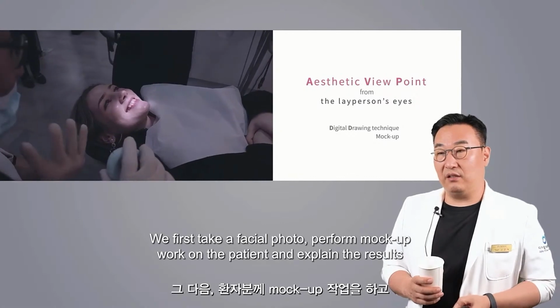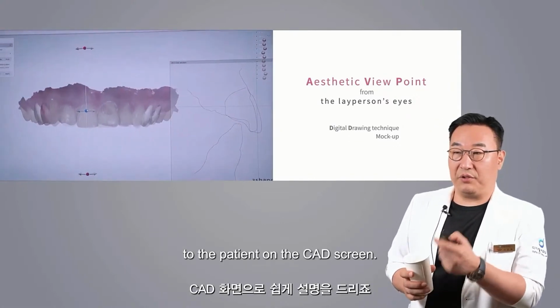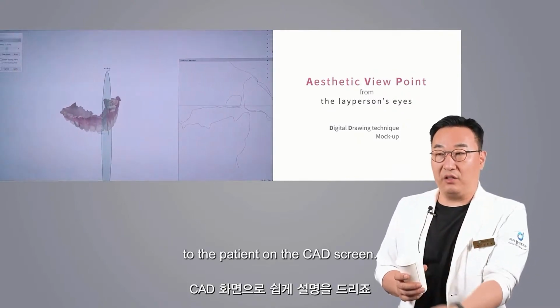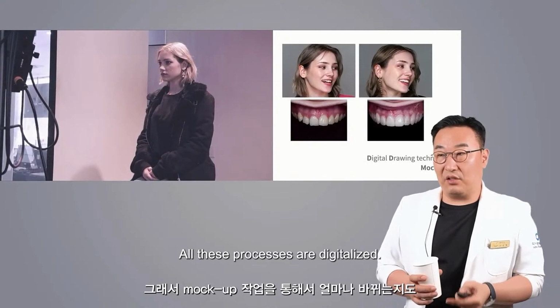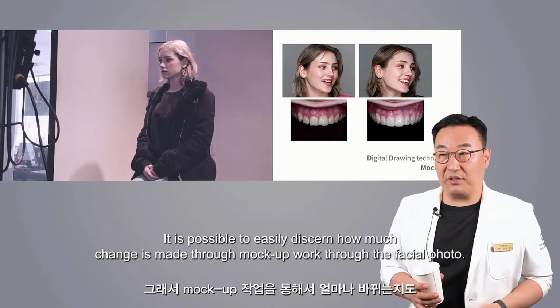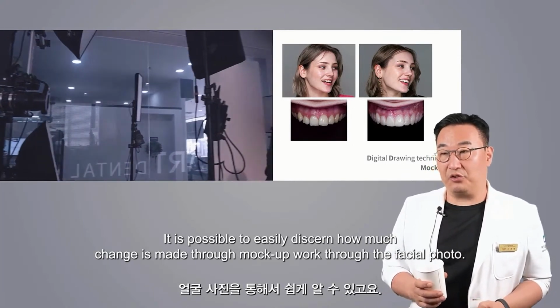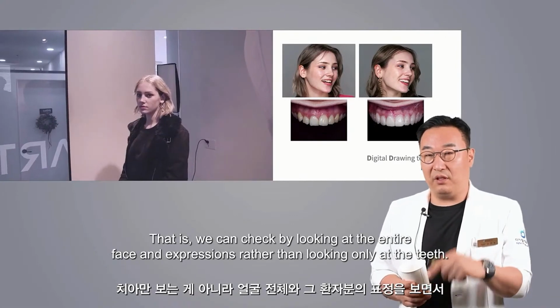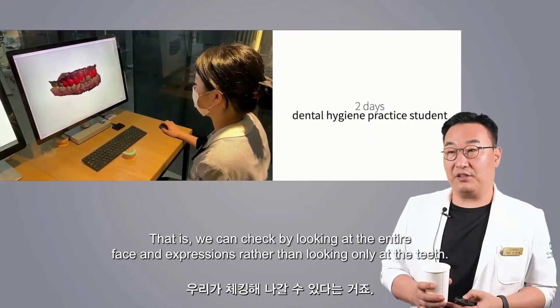We first take a facial photo, perform mock-up work on the patient, and explain the results to the patient on the CAD screen. All these processes are digitalized. It is possible to easily discern how much change is made through mock-up work through the facial photo. That is, we can check by looking at the entire face and expressions, rather than looking only at the teeth.